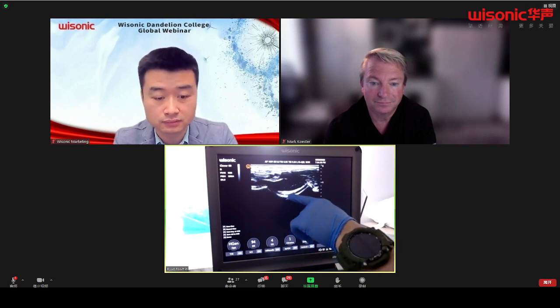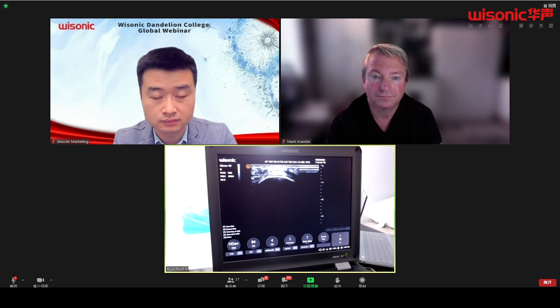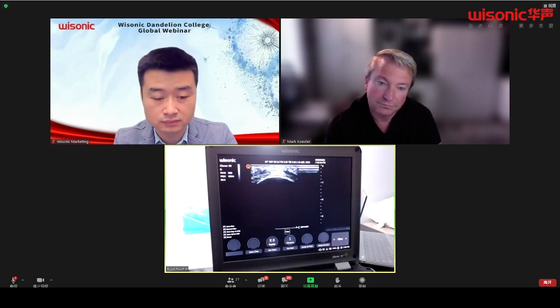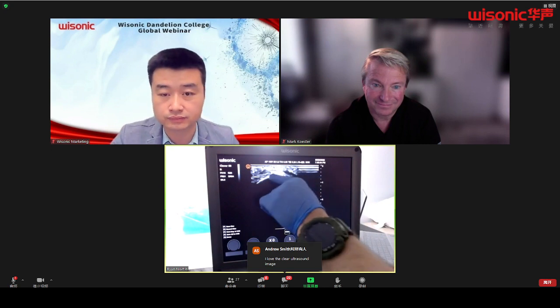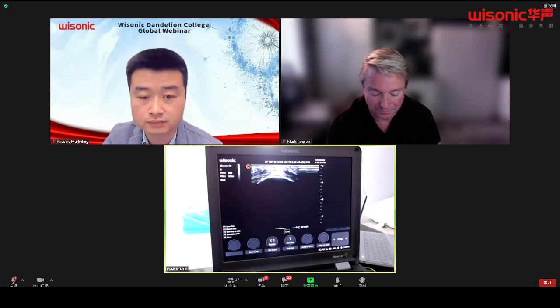And what happens is it gets to that hyaline. So now you get to that cartilaginous space. That disappears. And now you get this high-riding bony structure on top. Let me hit freeze. So now you have that bony structure on top. That's the olecranon process. And this cylindrical shape right on top. Looks pretty bright on my slab. Actually, it looks pretty good on here. But the cylindrical shape right up here is the tricep tendon as it attaches to the olecranon process right here.